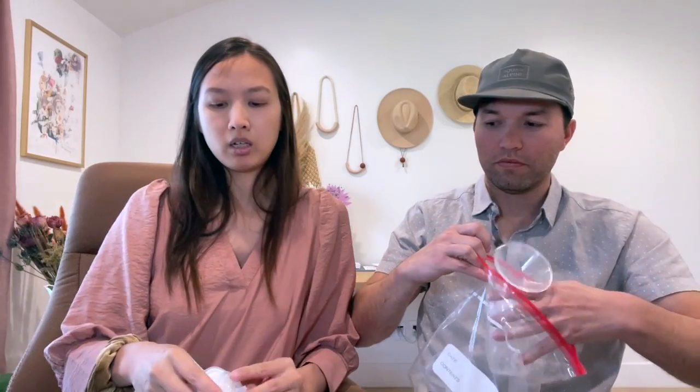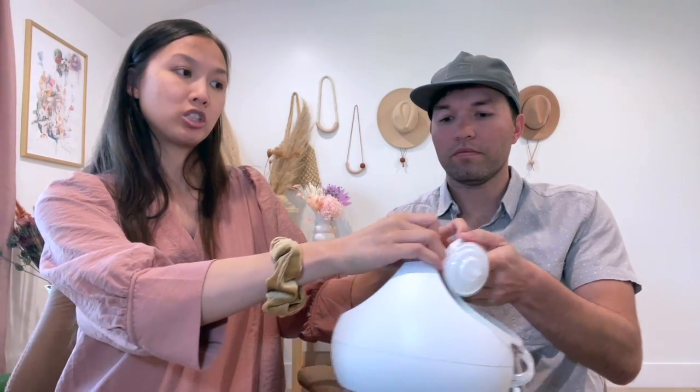I was kind of nervous about the pumping process, but I was able to read the manual one time and then get it. So if you have any more questions about pumping, I really found value in lactation consultants.